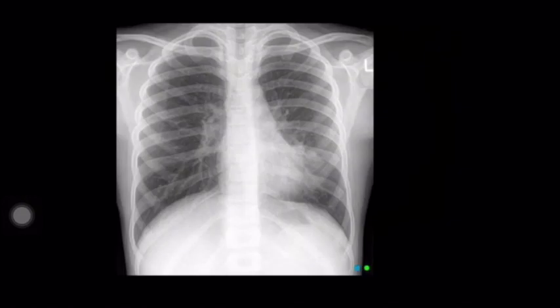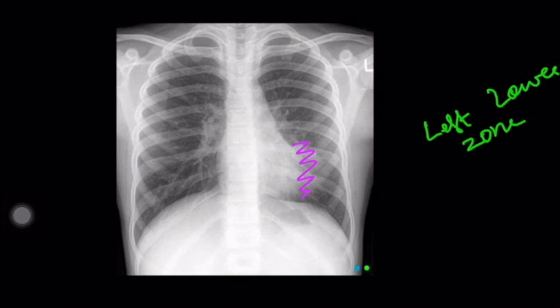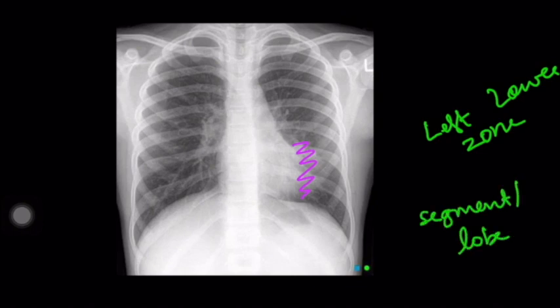In this frontal radiograph, you can see there is an opacity here. You can use terms like opacity in the left lower zone — we have previously seen how the lungs can be divided into zones — but can you make it further better? For that, you can apply the Silhouette sign so that you can give added adjectives to localize the lesion, for example, to a segment or a lung lobe.